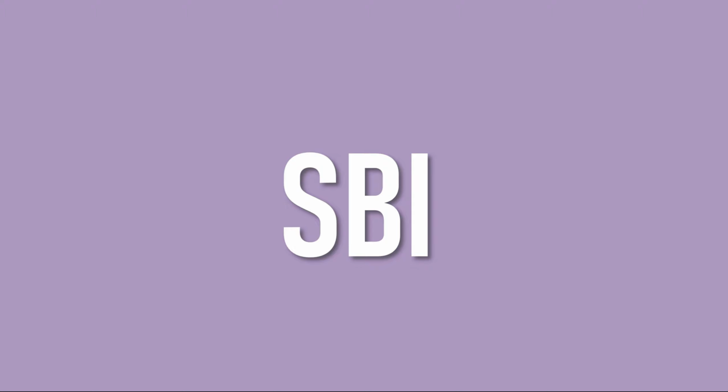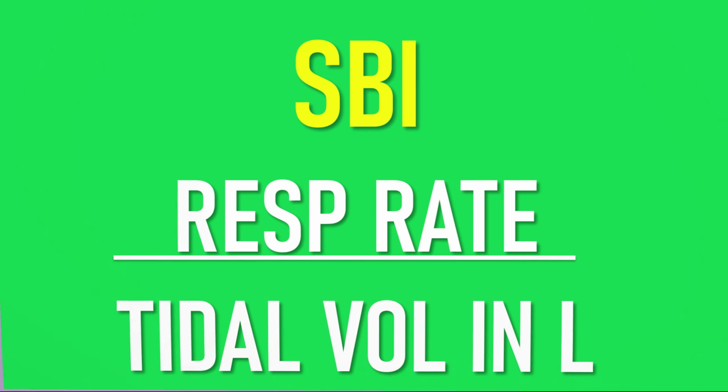the spontaneous breathing index. Now, sometimes you'll hear about a shallow breathing index or a rapid shallow breathing index. They're all exactly the same, but the term I use is spontaneous breathing index, and it's very simple. It's the respiratory rate divided by the tidal volume in liters. That means that a 300 ml tidal volume is 0.3, so the respiratory rate is divided by 0.3.